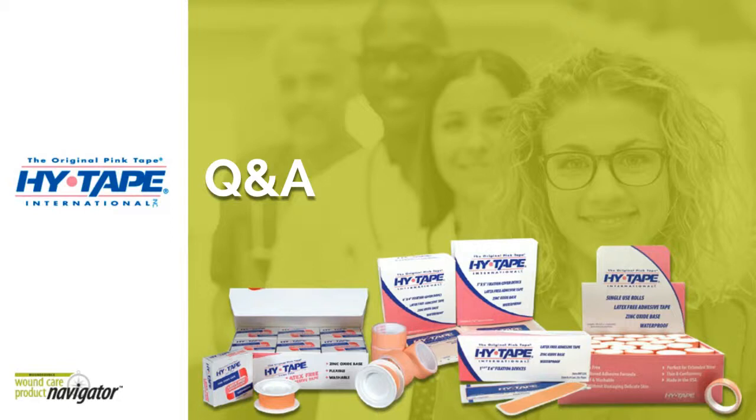What is the best way to apply HyTape to older skin? The best way to apply it would be a clean, dry surface. No skin prep is needed whatsoever. Maybe just an alcohol wipe if it appears to be oily, but we recommend just a clean, dry surface no matter what skin type we're dealing with.